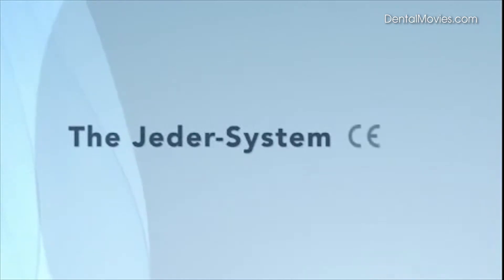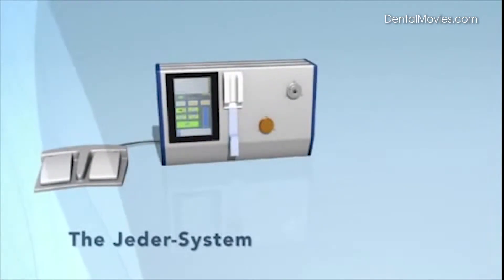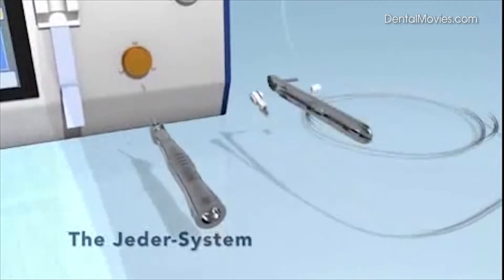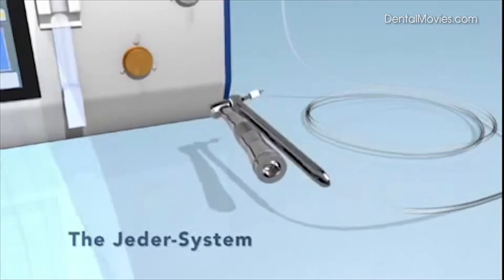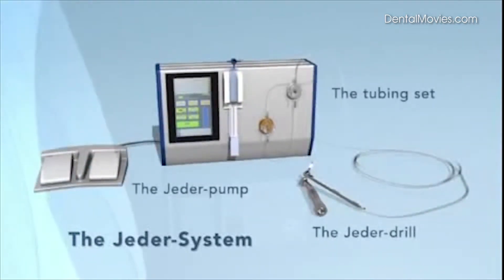The Jader system is CE certified and consists of three components: the Jader pump with control display, controlled by foot pedal; the Jader drill, the actual surgical tool; and the tubing set that connects the Jader drill to the Jader pump.